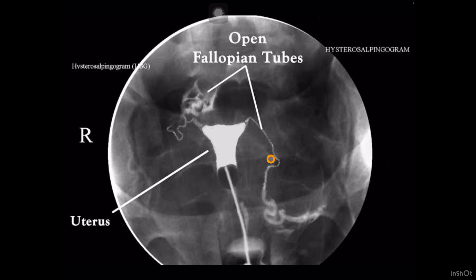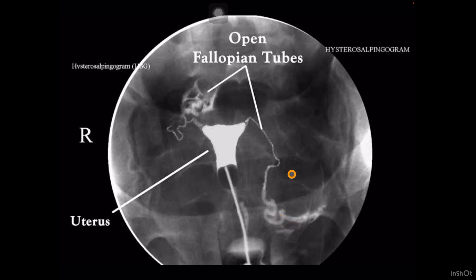Bismillahirrahmanirrahim. Today I am going to tell you the different parts of the fallopian tube on hysterosalpingography study. Contrast is given through the Leach-Wilkinson cannula when we do the hysterosalpingogram procedure. We should know the different parts of the fallopian tube, because some diseases like salpingitis isthmica nodosa only involve the isthmus part, so it is necessary to differentiate between different parts.